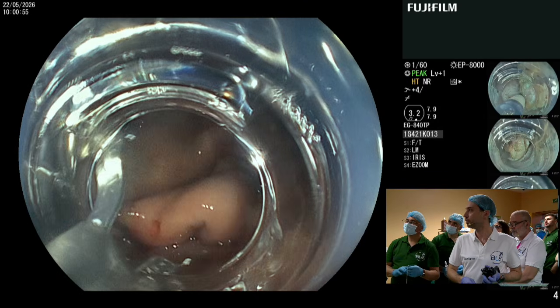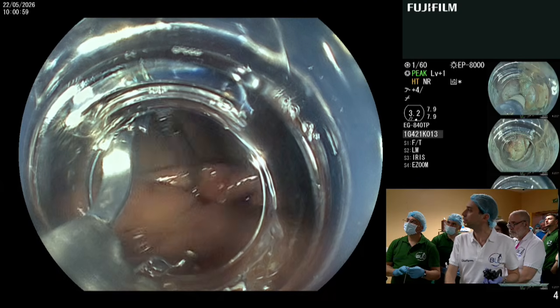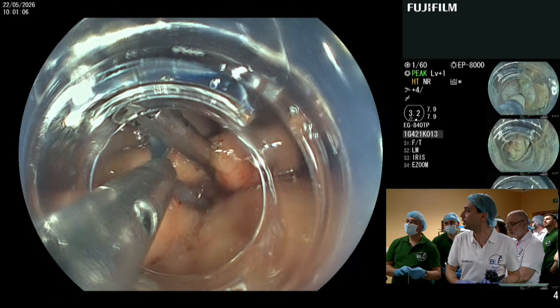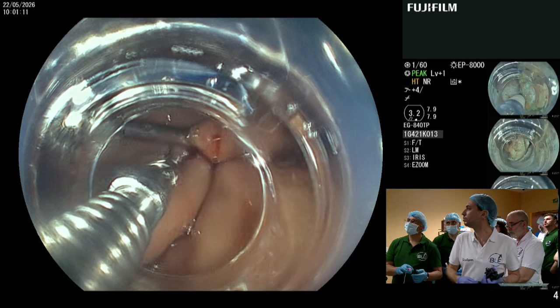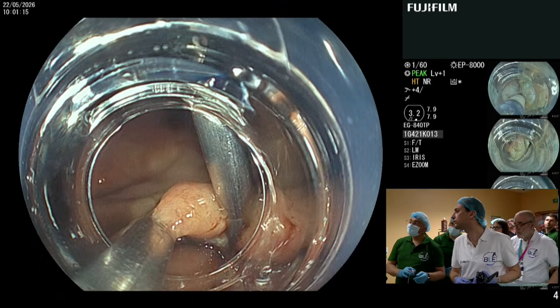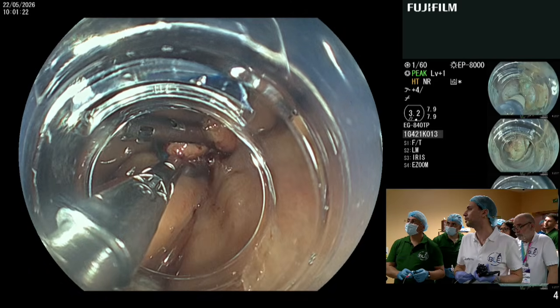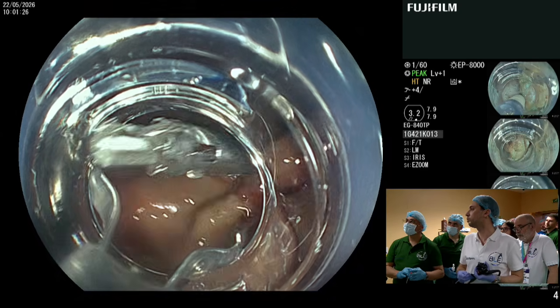Open. I can still rotate it. Okay, let's try here. All right, here, it's good. I will rotate. You have opened completely? It's open. Close. It's good or not? No. The other. I'm not sure. Open. The other. Here it's better. All right. Close. It slips. That's why we have to use. Okay, open. Give me one more mantis clip. Okay.